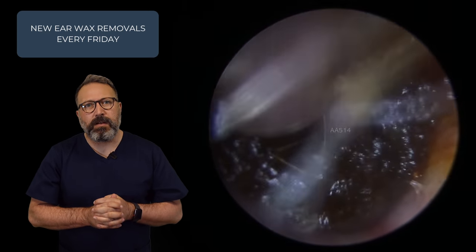We had to spin it just to get it out of the recess. A little bit of blurring on the camera — that's just a little bit of oil residue left over. Light reflex there as well, but not quite as present as on the other side. So we've got an inch and three eighths, just under three and a half centimeters, but some big old meaty chunks of wax — really, really blocked up that poor patient, but hearing much, much better when I left.